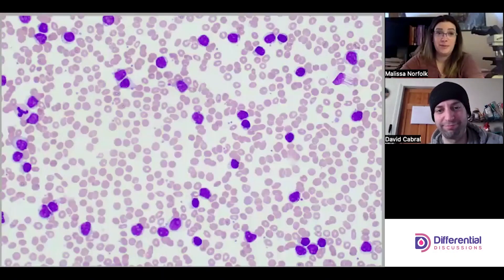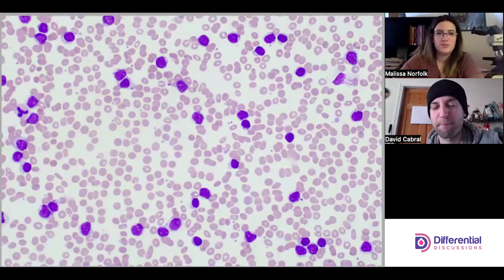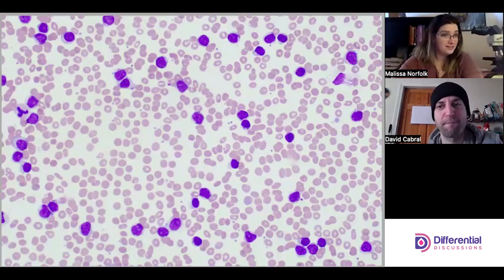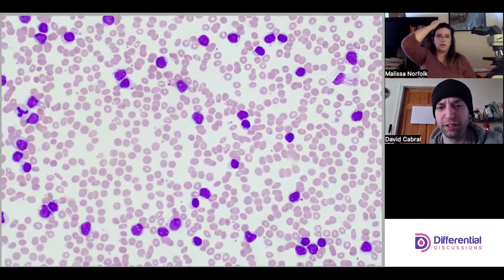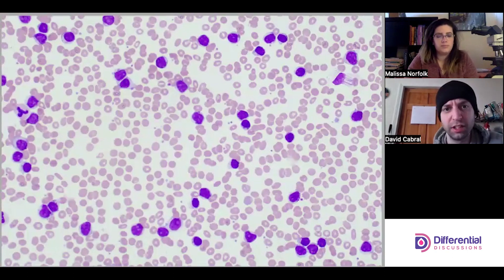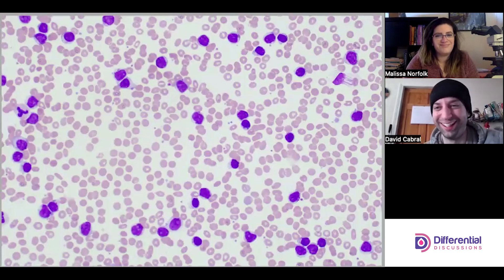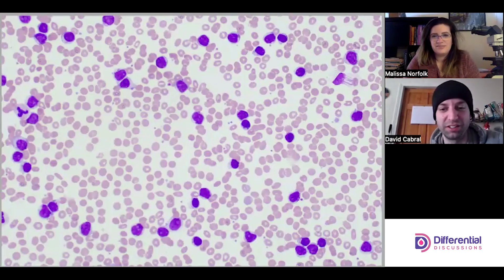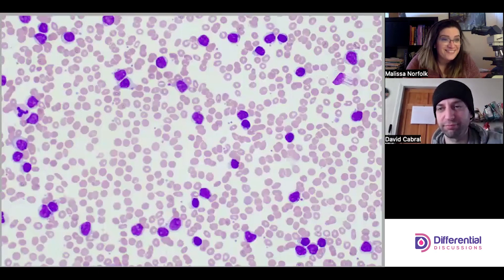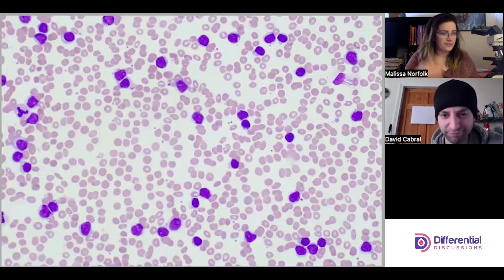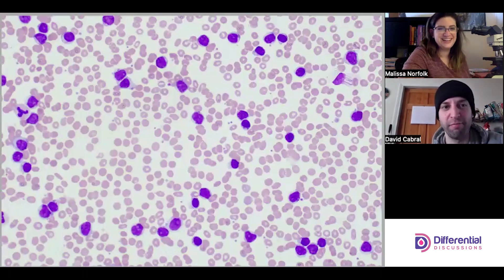Hello and welcome to Differential Discussions. I'm Melissa and I'm Dave. Today we're going to be looking at an LGL-CLL. Most CLLs we've seen are B-cell origin, and there are T-cell CLLs, but these are some pretty big lymphs. This is a slide given to me labeled LGL-CLL with no other results, so this is the first time Dave and I are looking at it — it's going to be an adventure.